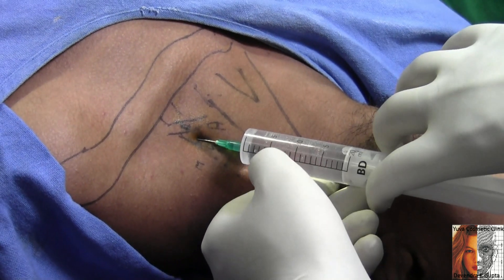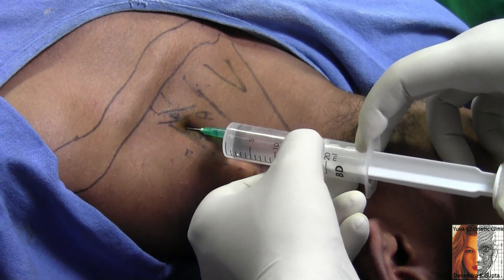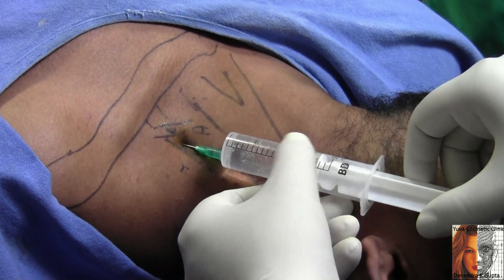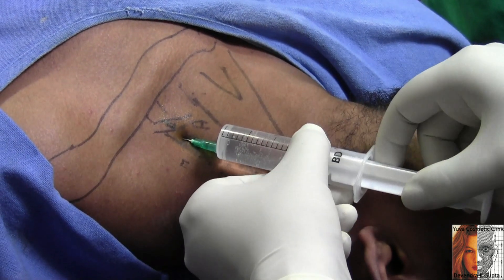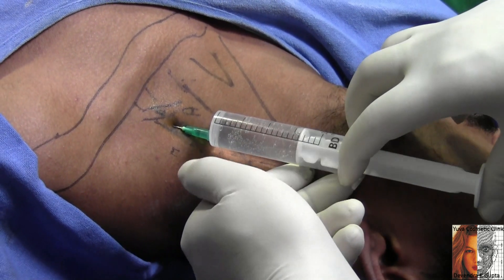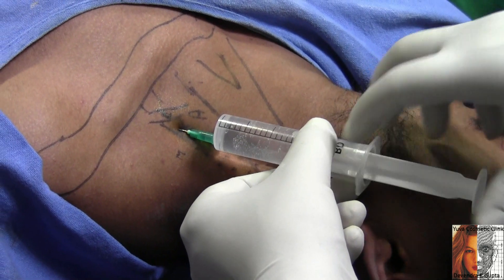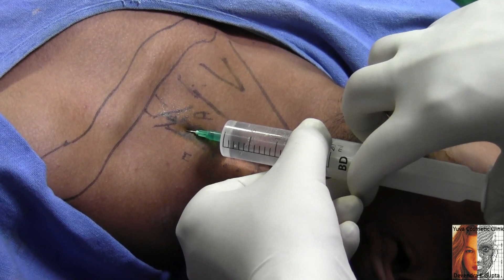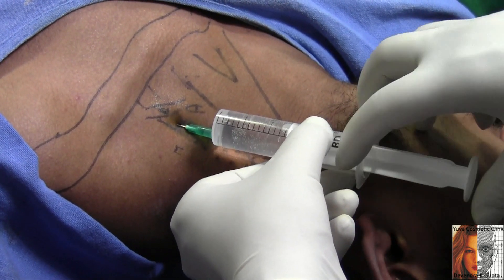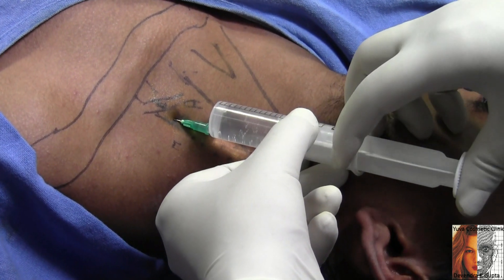Aspirate — there should not be any resistance. Aspirate and inject. Keep watch on the pulse and always avoid accidental intravascular injection. There is no resistance and no blood. Inject a little bit, aspirate, inject, rotate in many planes to avoid accidental intravascular injection. The technique is simple and I am not purposefully eliciting paresthesia.